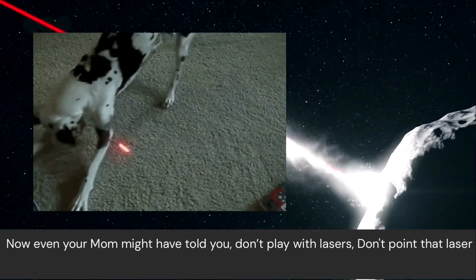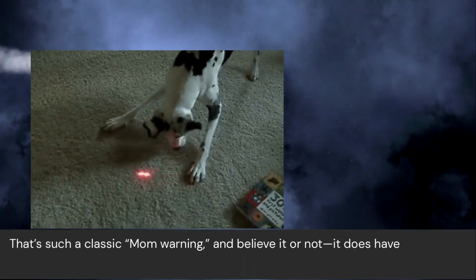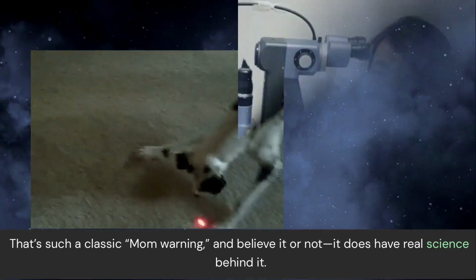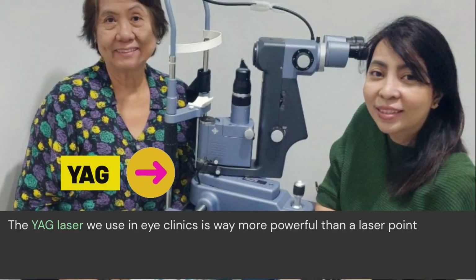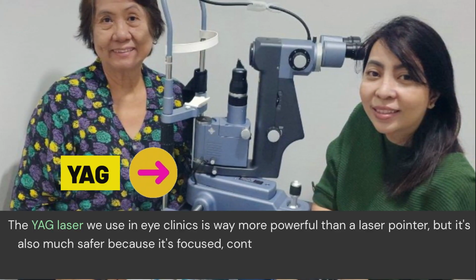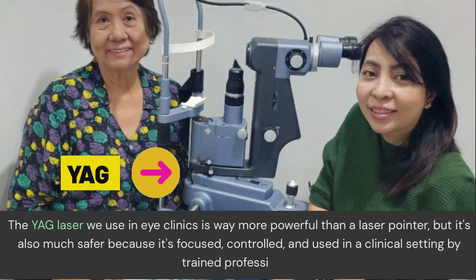You see, even your mom might have told you, don't play with lasers, don't point that laser at your brother's eyes. That is such a classic mom warning, and believe it or not, it does have real science behind it. The YAG laser used in the eye clinic is way more powerful than a laser pointer, but it's also much safer because it's focused, controlled, and used in a clinical setting by trained professionals.